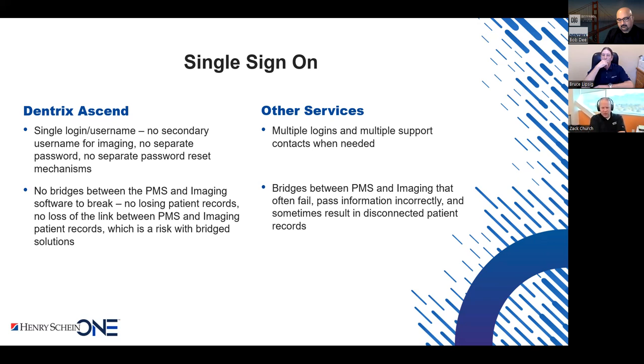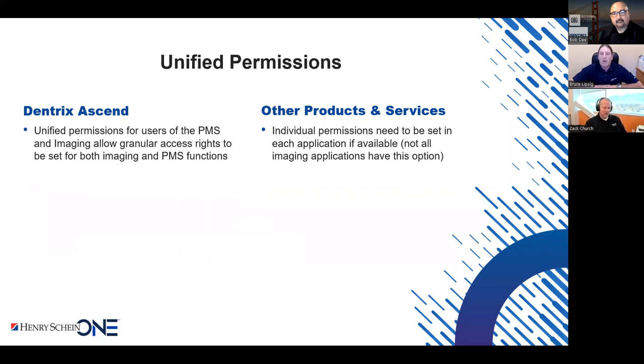And you mentioned before that other bullet item, no bridges, whereas a lot of other systems have that bridge where you jump in between systems. One number to call is very, very important. And also, if something is something the support cannot figure out, your team jumps in, Bruce, right? Like some doc bought a new sensor and now they don't know how to configure it, and that support may not know. I know that the Real Cloud team gets in and fixes it right away for them.